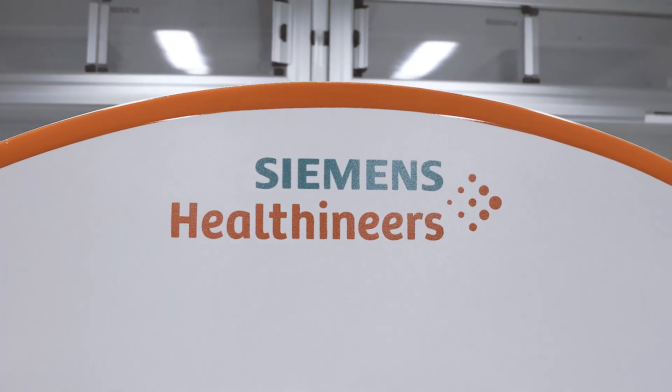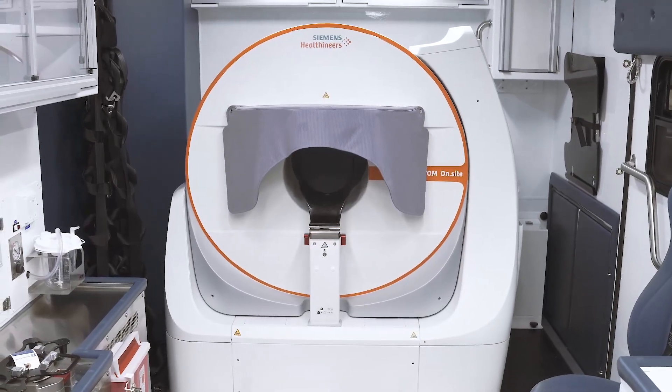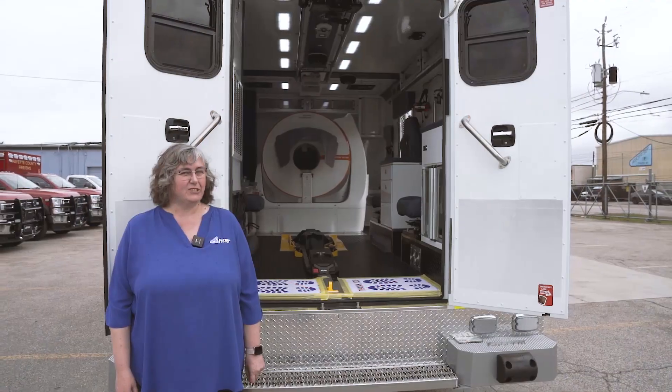This year, we built two of them for UCLA, and it's the first unit in the United States with a Siemens OnSite scanner. We're so excited to tell you more about that in just a little bit.